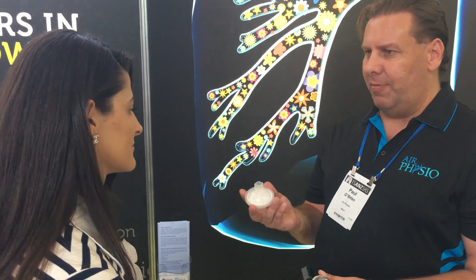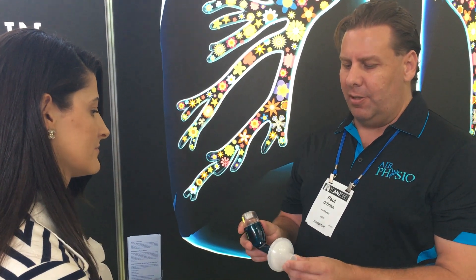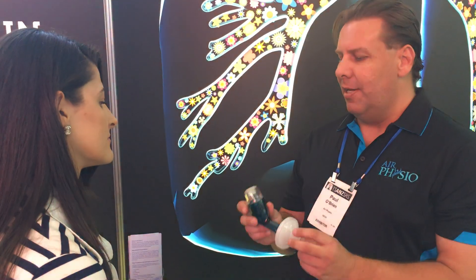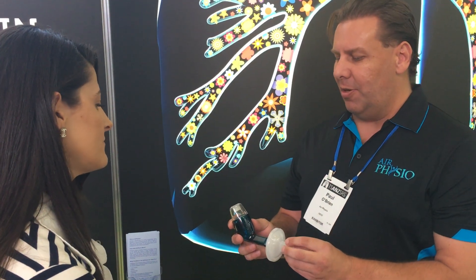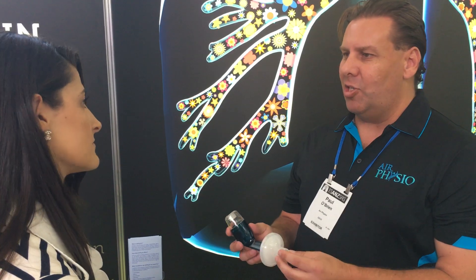The device also has a filter that goes inside it, so that all the bacteria and pathogens are held in the filter instead of going into the device itself. This means the patient can blow into the device and then simply change the filter.